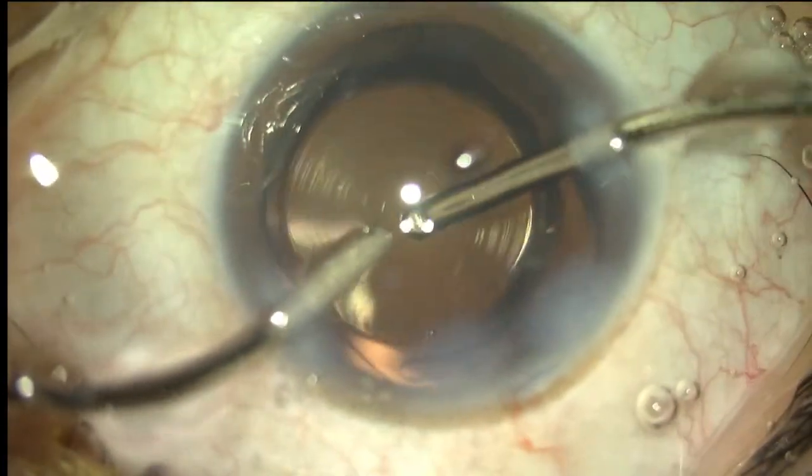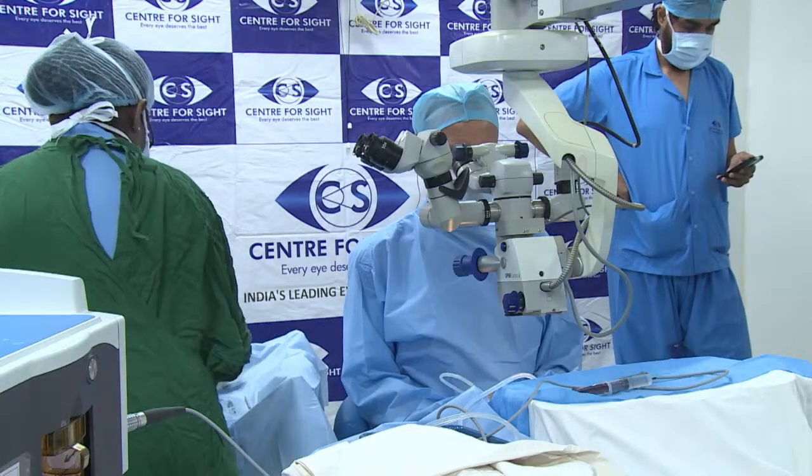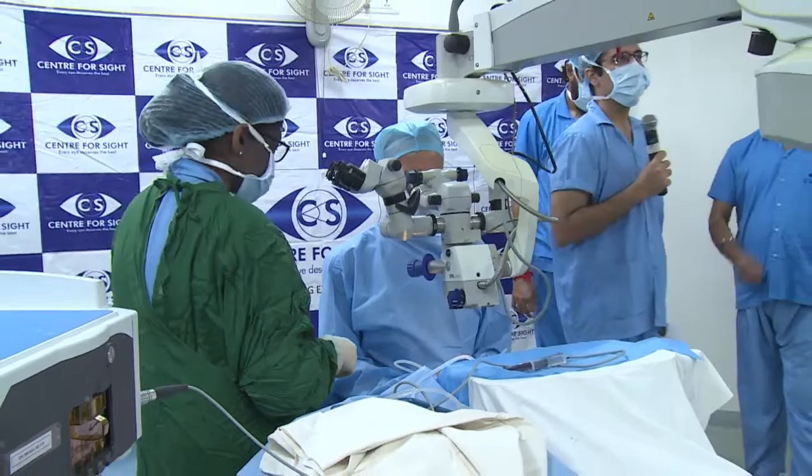Thank you, RP sir. On the case, we all know how RP sir can do hard cases so well. The soft cataract was also done so well. Thank you, sir.